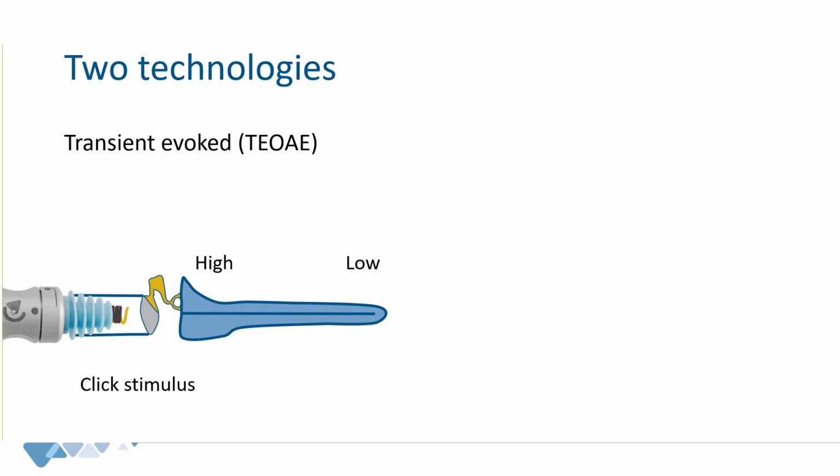They travel into the ear all at the same time, but they do not reach their dedicated place on the basilar membrane at the same time. So when the OAE is generated, they travel backwards at different times. And that means that in the timeline, when measuring TOAE, you will first get high frequencies back, then middle frequencies, and lastly the low frequencies.